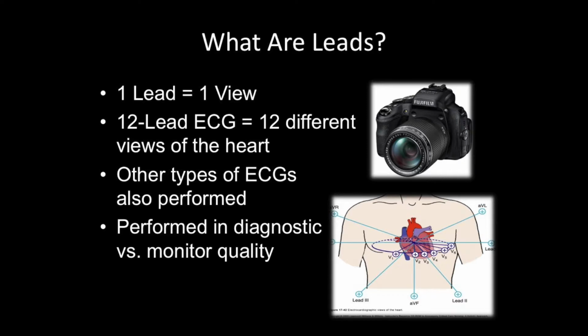So we generally look at the left ventricle. If your left ventricle poops out, you've got big issues. If your right ventricle poops out, you have issues, not as big as your left, okay? So that's why we generally look at this. So we talked about other types of ECGs performed. There's even more, but we'll just leave that where it is.